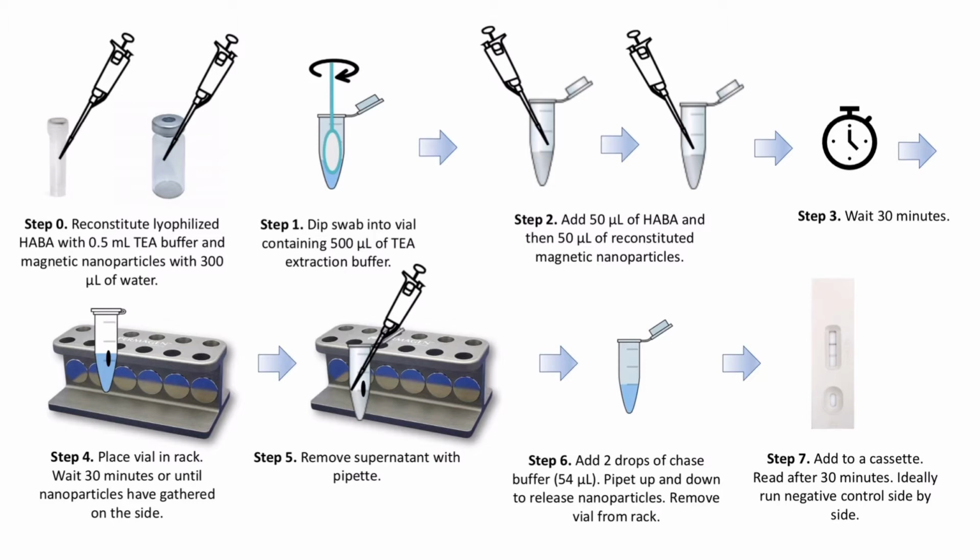The HABA and lyophilized nanoparticles are reconstituted. Next, a swab from the lesion is dipped in the extraction buffer. In step 2, the HABA and lyophilized nanoparticles are added and incubated for 30 minutes. During this time, any mycolactone present in the sample will adhere to the nanoparticles. At this point, the vial is placed in a magnetic rack, and the nanoparticles accumulate on the walls of the vial as shown in step 4.